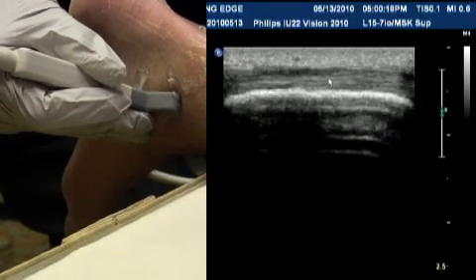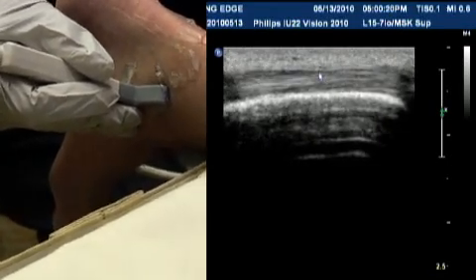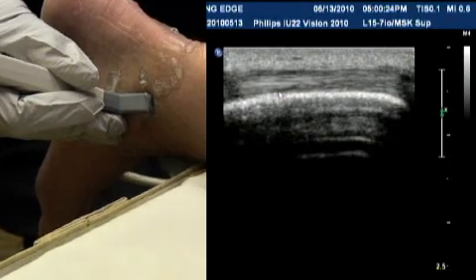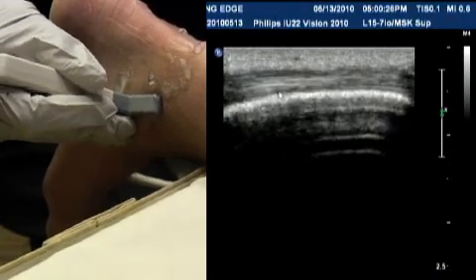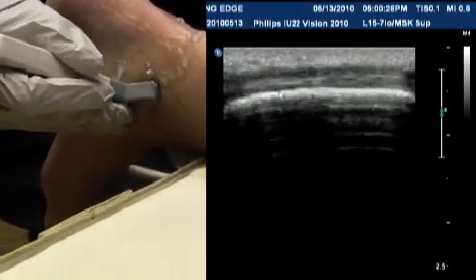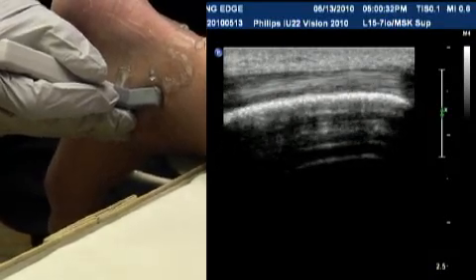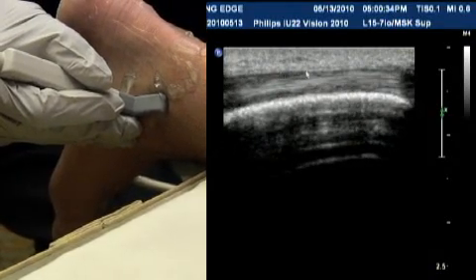Now, what you also see usually in many tendons is a hypoechoic area on both sides. That's just a normal sheath, or the tendon sheath that you see. Most tendons have tendon sheath. The Achilles does not have a tendon sheath. So what happens many times, you'll have an inflammation of a tendon sheath and not the tendon.